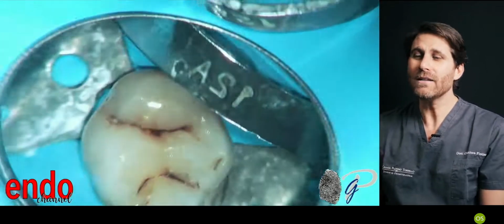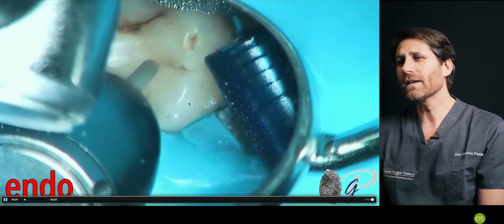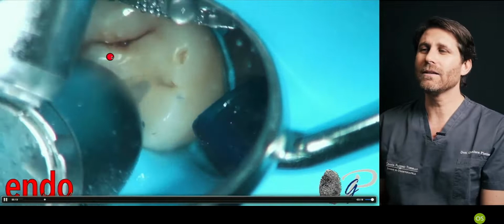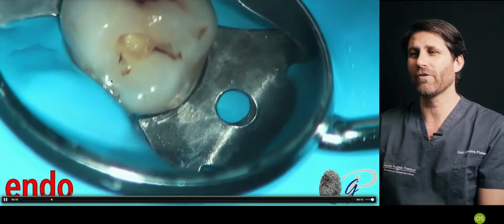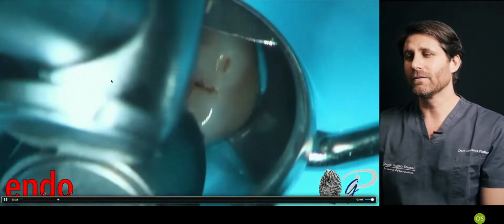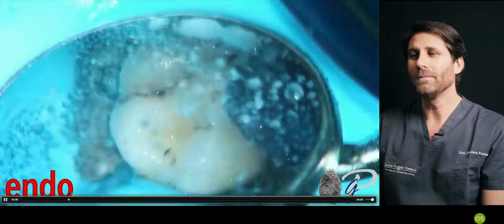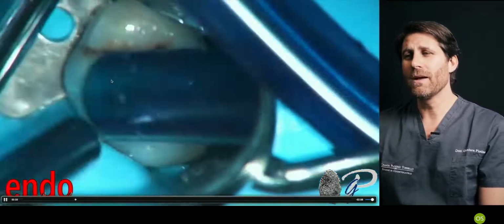and we start from an occlusal surface that is intact, so we can shape our access cavity. And in the shape of our access cavity, we should maintain as much as possible this oblique enamel dentin part of this upper molar that is a very important structure for the resistance of the tooth. So we move the starting point of the access cavity to the mesial aspect of the upper molars, because the pulp chamber is moved mainly on the mesial aspect of the tooth.